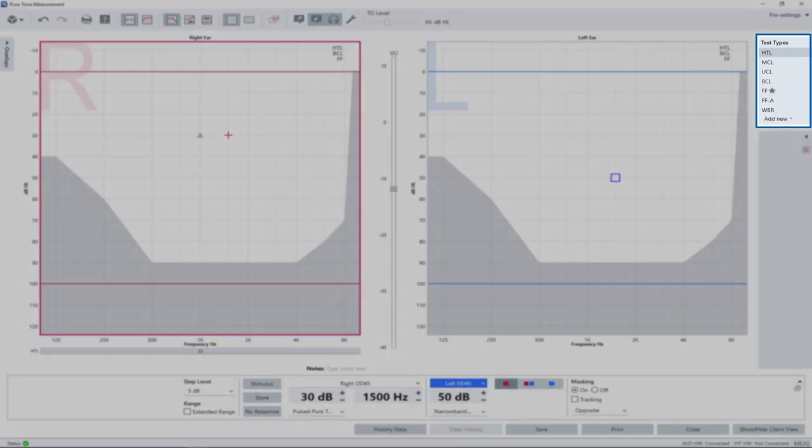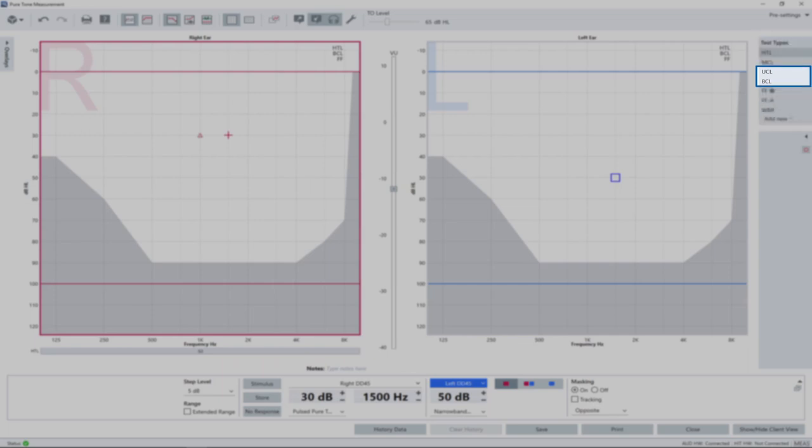You can measure all other curves such as the bone conduction level or the uncomfortable loudness the same way.